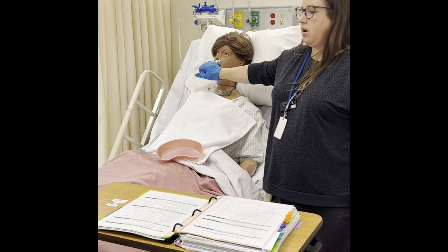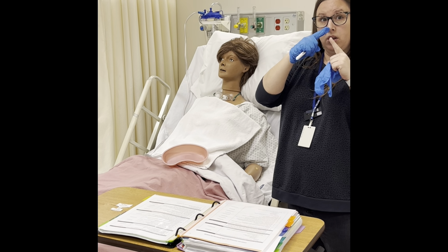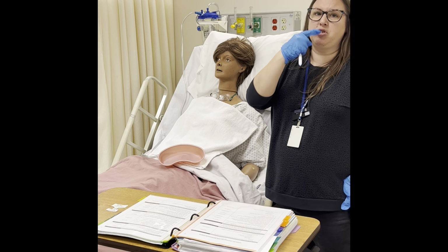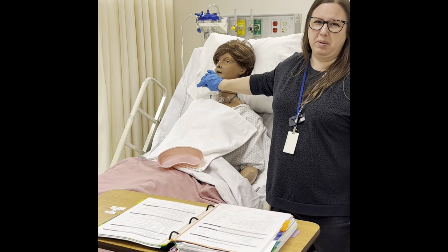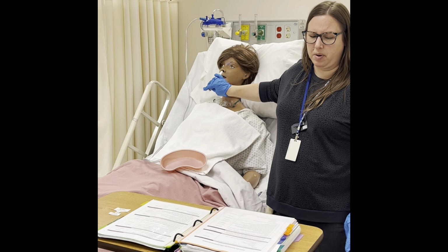What we're looking for, again, they have a deviated septum. Is there like a hole through the middle of their nose? Do they have any irritation? Did they try to put a tube in the emergency room and one side is super swollen, and you can see sometimes cuts or something? That's probably not the side. We have 2 nostrils. Maybe we want to go on the other one.